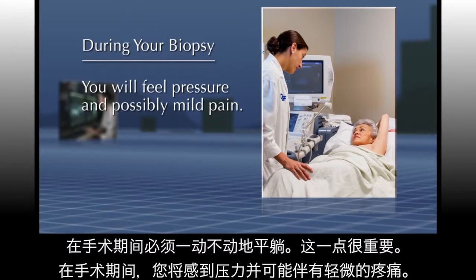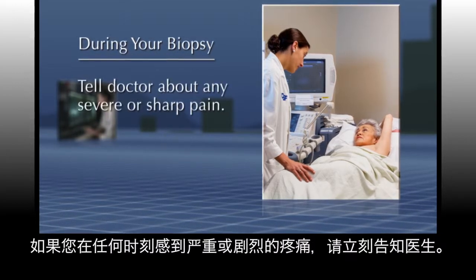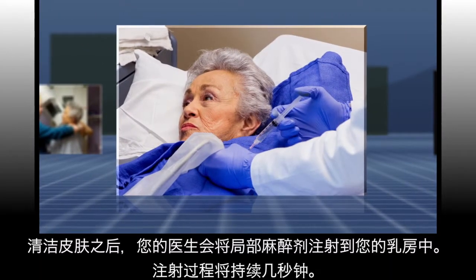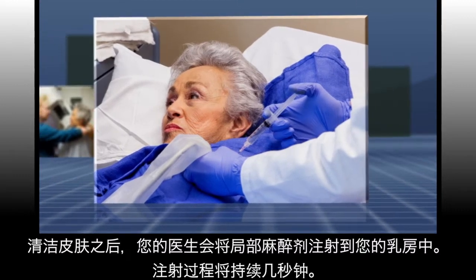You will feel pressure and possibly mild pain. If you feel severe or sharp pain at any time, let your doctor know. After cleaning your skin, your doctor will administer local anesthetic into your breast. This will sting for just a few seconds.